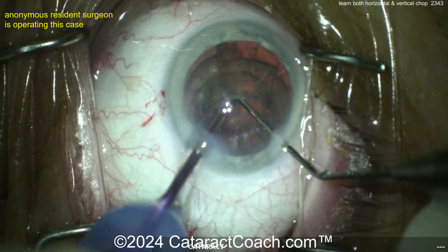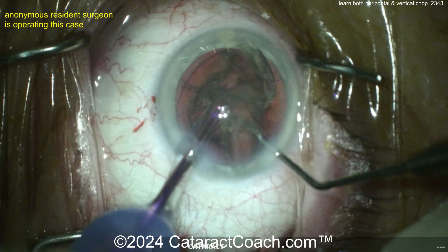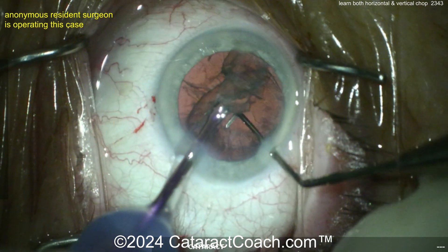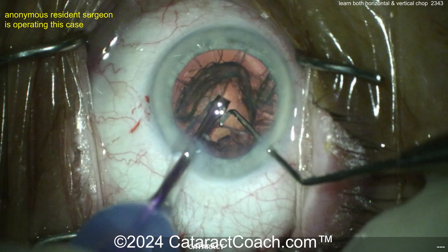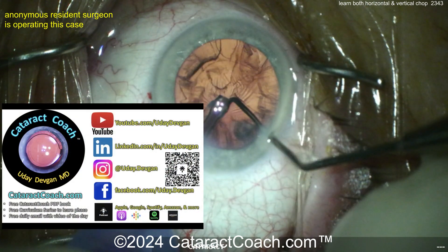You saw our video earlier this week about the epinuclear flip — that's what you want to do here. Flip that thing. But okay, this works too — just slowly aspirate it. Very nicely done. By the way, it looks like the surgeon's left-handed. Looks great. Beautiful job here. In fact, the best is if you can use left hand and right hand equally well, and this surgeon is doing a beautiful job. I commend you, anonymous young resident.